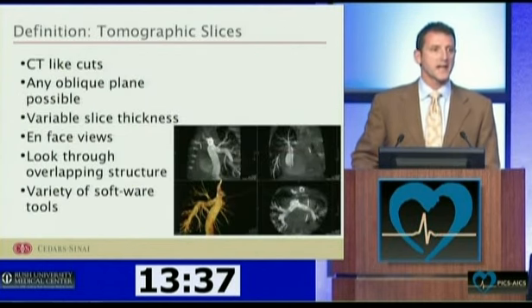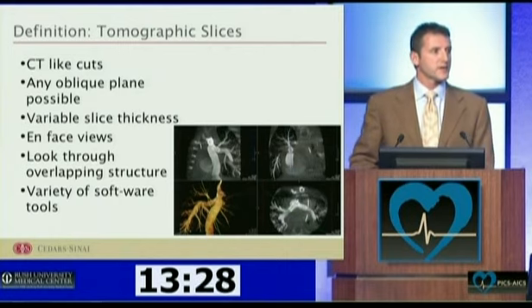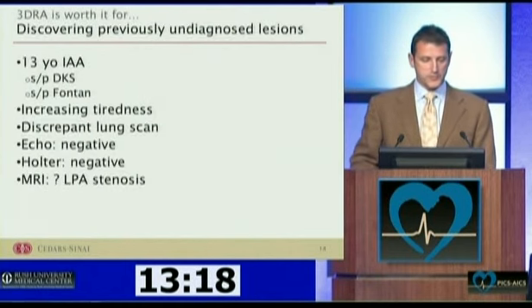And then there are the CT-like cuts, which I believe at this point I get the most usage out of and the most bang for my buck. These are CT-like cuts. You can really have an infinite amount of cuts that you can make. You can look at things en face for the first time. I think that's pretty important. And there's a whole lot of software that goes along with this that lets you do lots of neat things, which I'll show you through some cases.